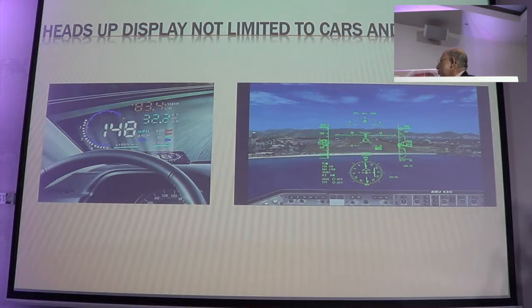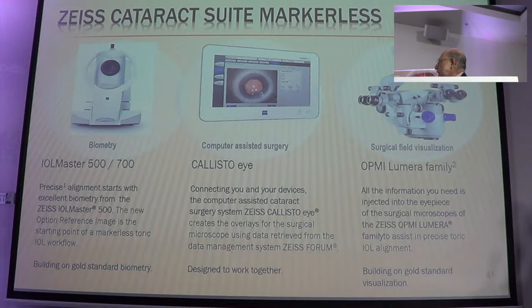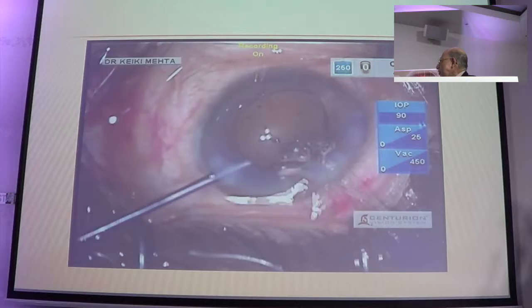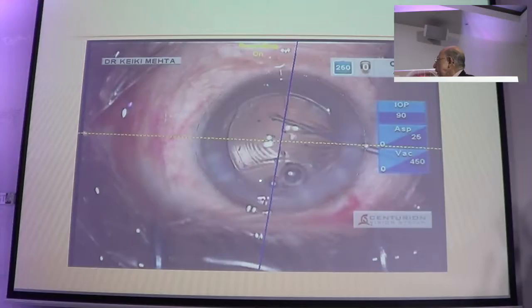Heads-up display is not new — they are in cars, they are in airplanes. It will now come down to our instruments, where they use a combination of the eye tracker and the telescope. This gives you a marking which comes in your right eyepiece, enabling you to get perfect alignment running down the line. As you will see here, with this trifocal lens being implanted, notice the axis running down the line, and the horizontal plane.